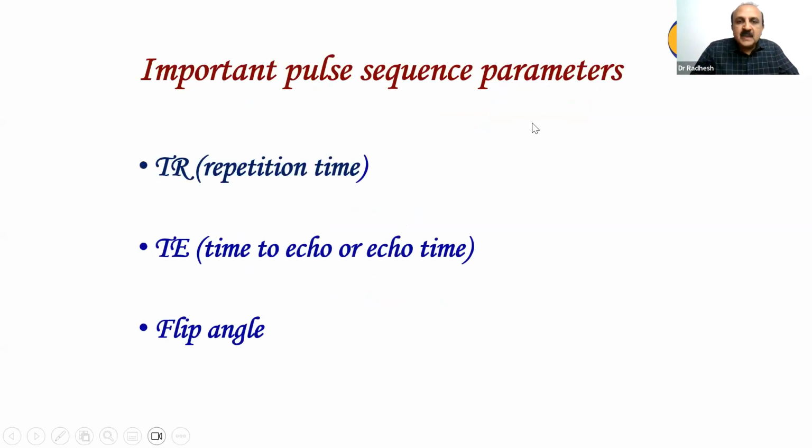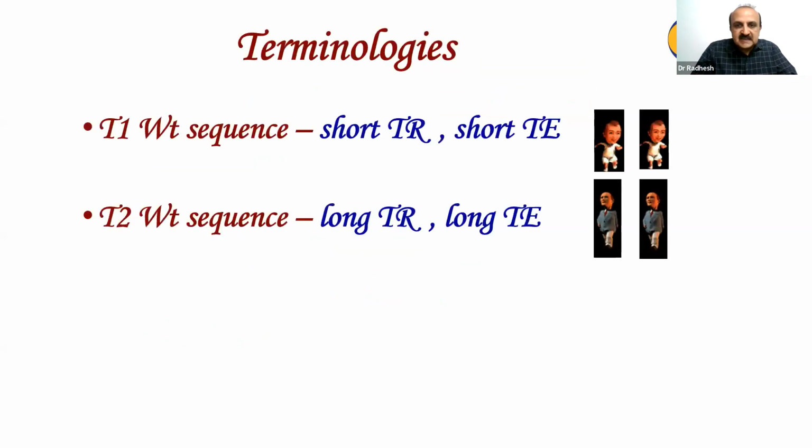Now, what are the important pulse sequence parameters? Okay. Before that, I'll just go to the next slide. There are two sequences which you need to know and which are commonly used. What is a T1 weighted sequence? What is a T2 weighted sequence? Okay. And for you, don't look at all this. Short TR, short TE, long TR, long TE. It does not mean anything to the clinician. I'm telling you. Okay, it's a waste of time. It is for the radiologist.